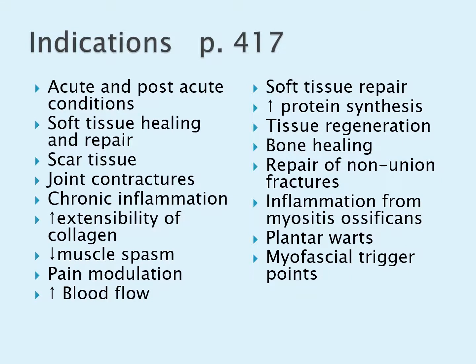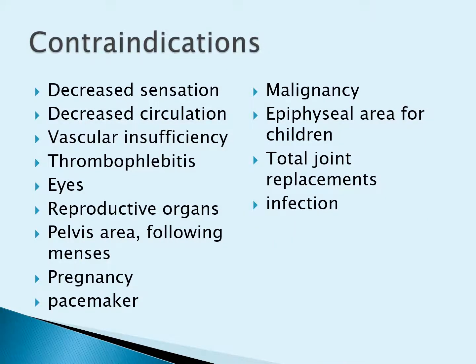So here are our indications: acute and post-acute pain, soft tissue healing. You guys can read through this. I'm not going to read through all of these. What you guys need to think about is contraindications. What are my contraindications? Decreased sensation and decreased circulation are all contraindications.